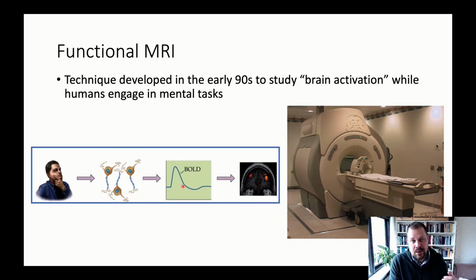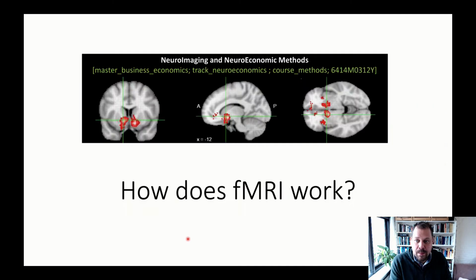When the brain sends more oxygen to regions that are active, we can see an increase in the BOLD response or increase in MR signal intensity, which you can then map using statistical analyses at a later point. Here's an example MR scanner. Typically, I take you to the MR site, but given the current situation, that's unfortunately not possible.